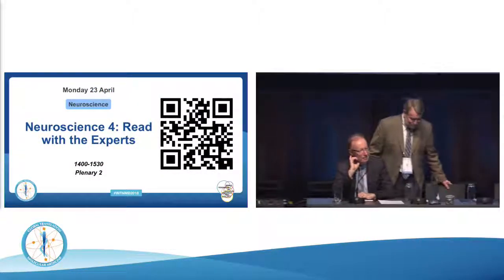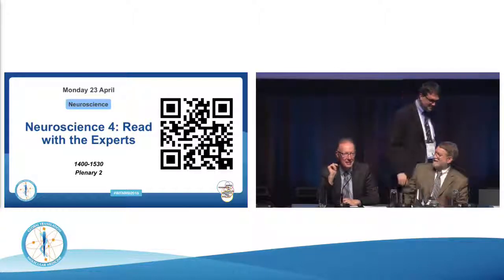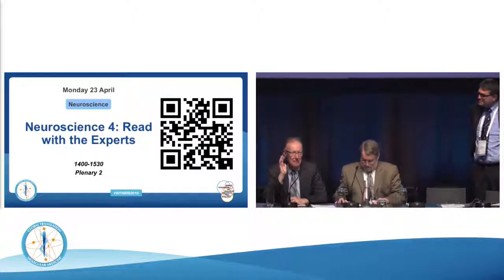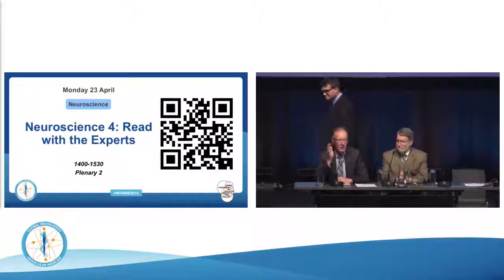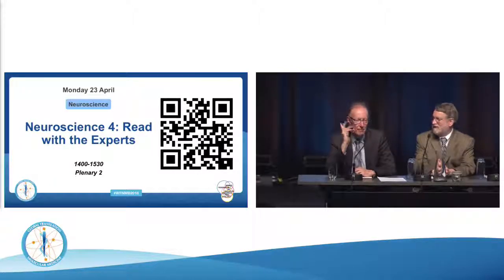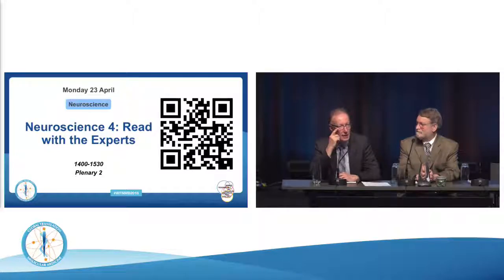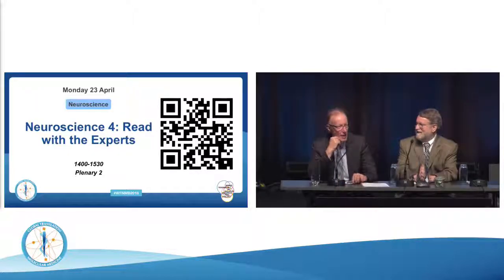Thank you. I'm just going to make a few comments. I did forget to mention in my talk on how to do an FDG PET that you do have to have the visual environment constant and reproducible every time you're studying a patient. So at our centre we have people eyes opened in a semi-darkened room. Do you darken the room? It's dimly lit so that it's not obtrusive. But you can see, that's the critical thing.